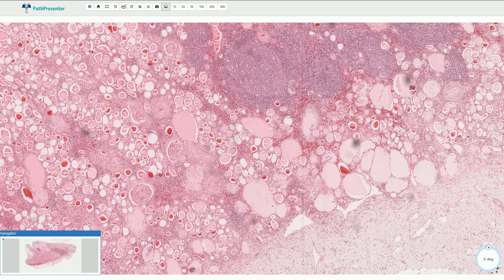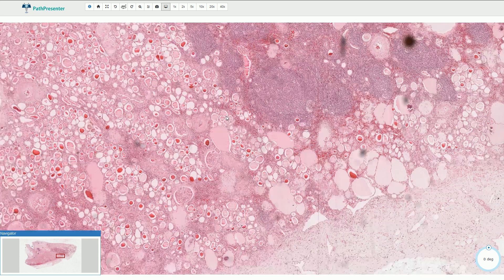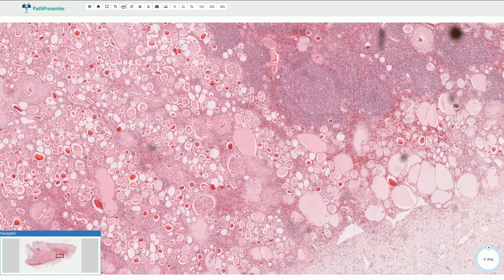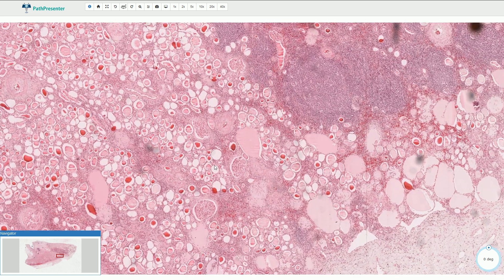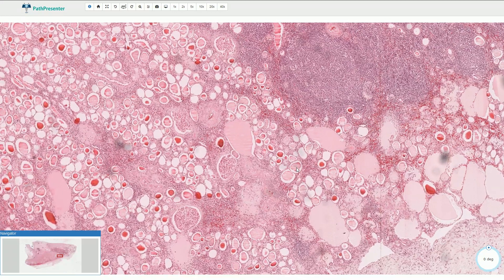Microscopically we typically see so-called thyroidization of the renal parenchyma. Here we are not looking at the thyroid gland — this is the kidney, and these structures are not thyroid follicles, but dilated renal tubules with atrophic epithelial lining.